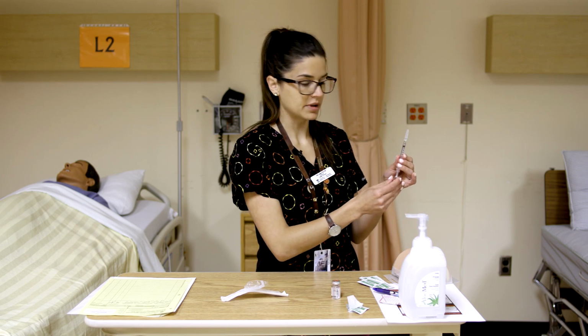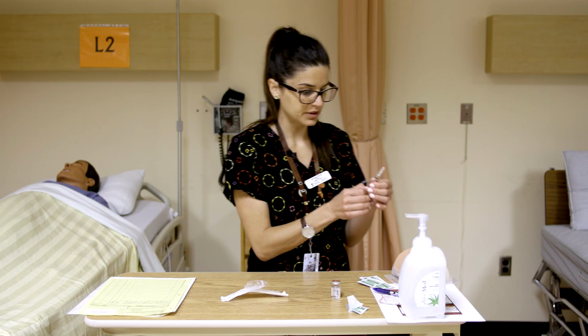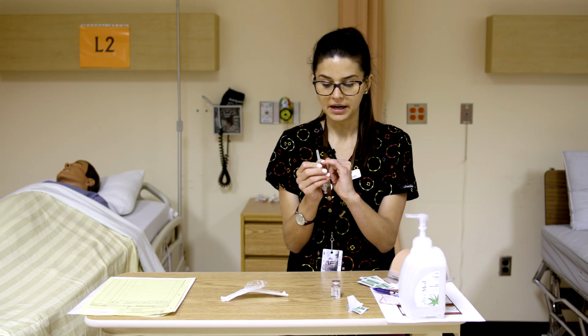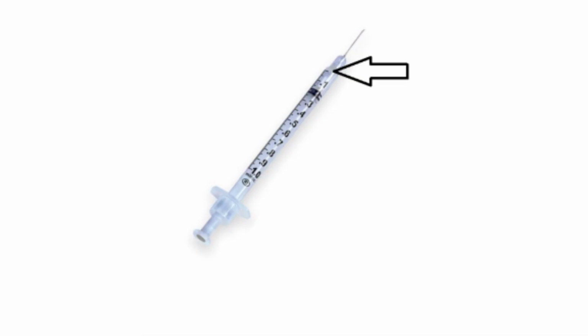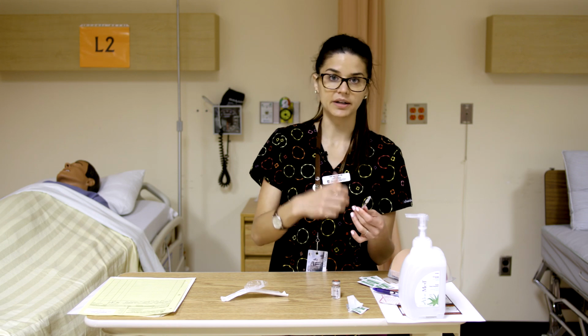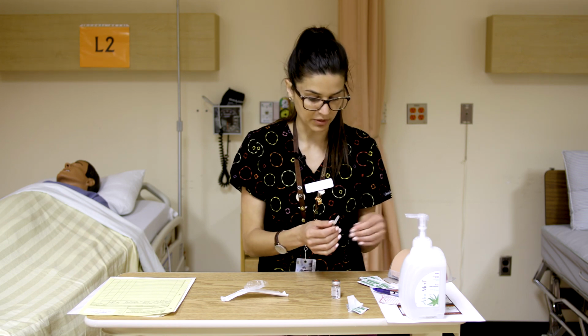So we're going to do this over the med waste disposal bin, that gray and blue one again. You will note with Vanish Point syringes, there is sometimes a point where you cannot get the bubble. There is sometimes an irremovable bubble at the top of that syringe. As long as it's above that first measurement marking, that is acceptable. And how you ensure that you get the correct amount is actually by activating the Vanish Point while it's still in the patient. So we'll review what that means when we go ahead and do it.